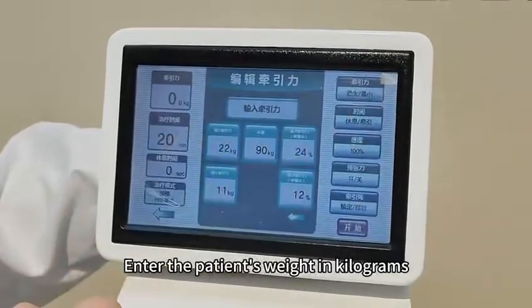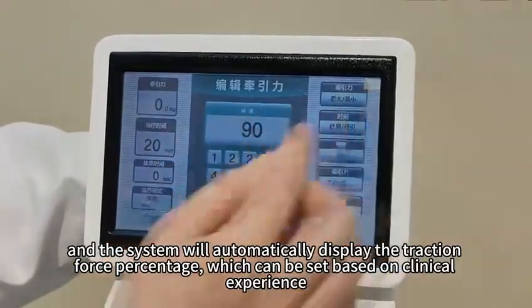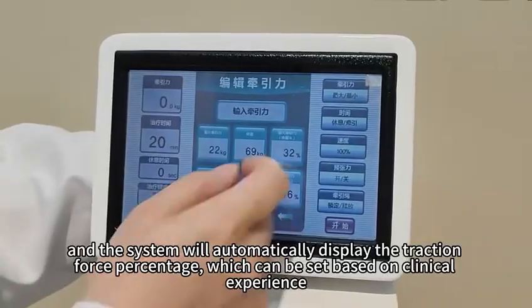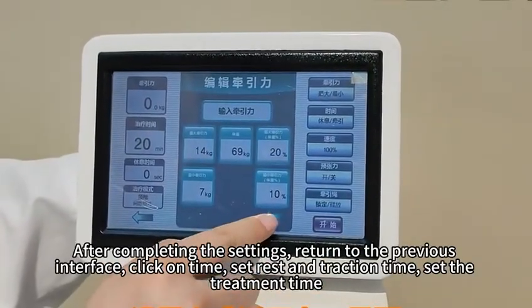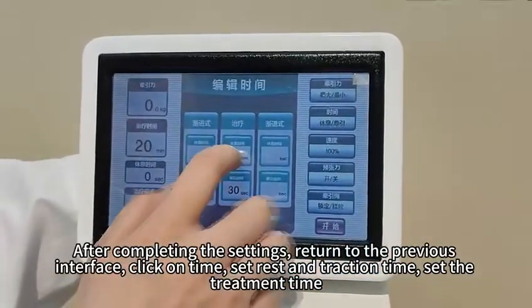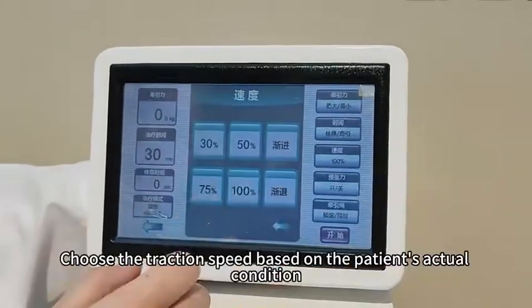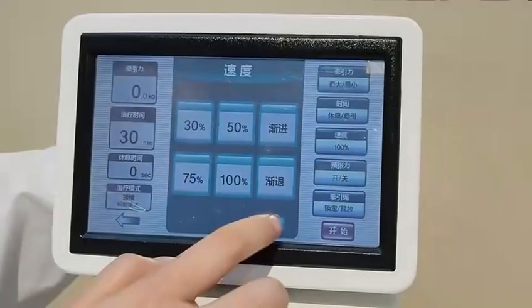Enter the patient's weight in kilograms, and the system will automatically display the traction force percentage, which can be set based on clinical experience. After completing the settings, return to the previous interface, click on Time, set rest and traction time, set the treatment time, choose the traction speed based on the patient's actual condition.